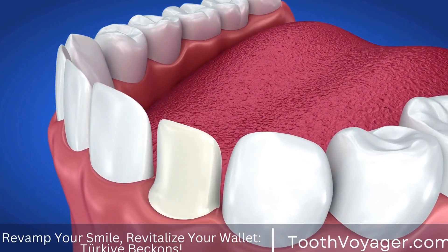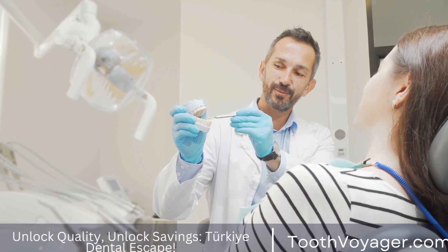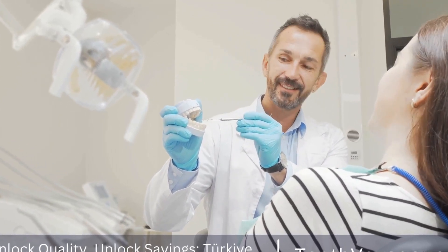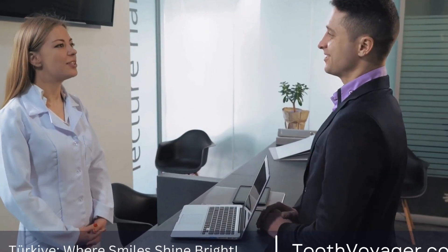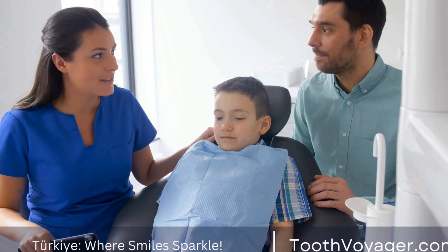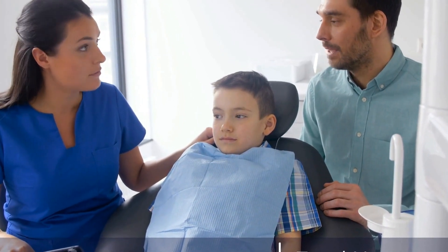Dental Bridges – What You Need to Know About Their Installation. When it comes to dental health, there are various treatments and procedures that can help improve the function and appearance of your teeth. One such treatment is dental bridges, which are commonly used to replace missing teeth and restore the natural look of your smile. In this video, we will discuss what dental bridges are, how they are installed, and what you need to know about their installation process.